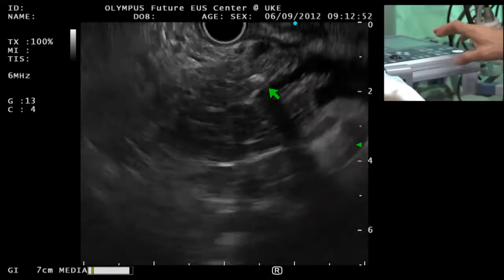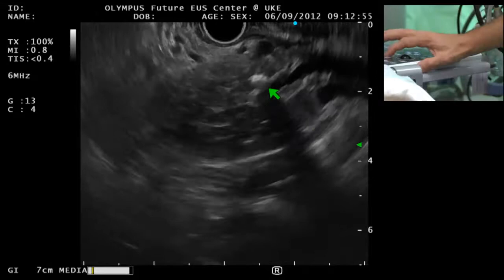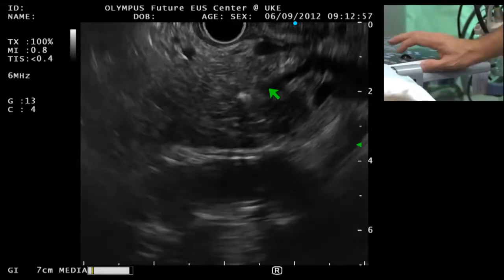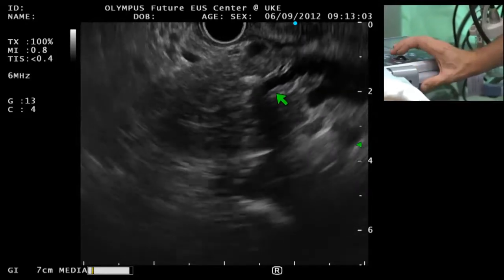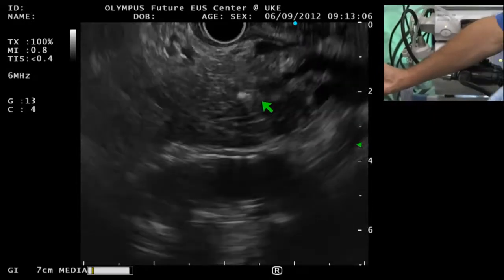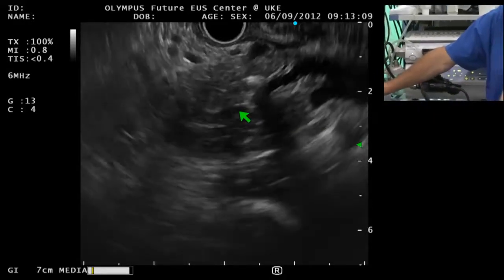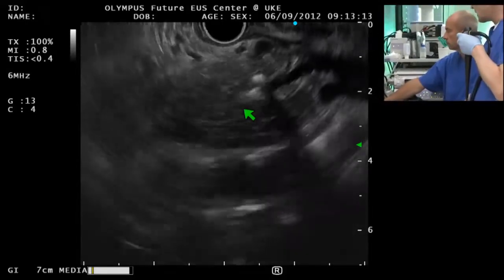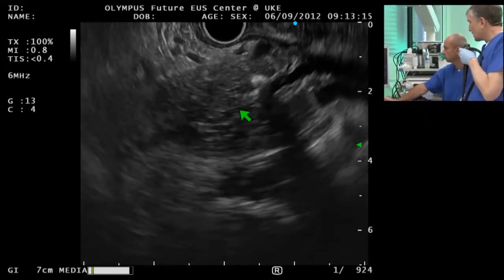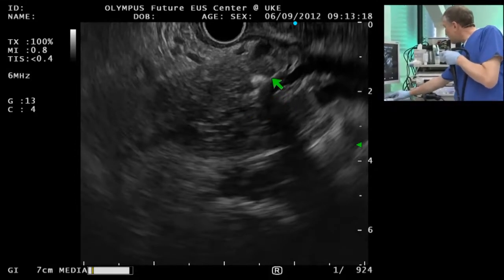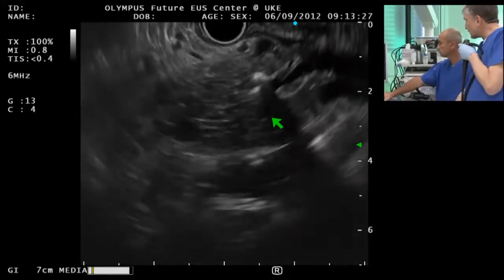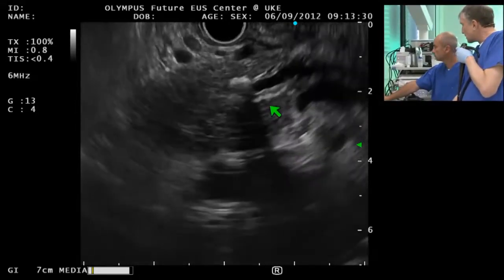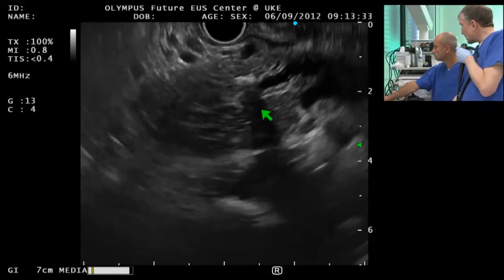Six millimeters. Because I was not really able on conventional EUS, on radial EUS, to see the transition. But I think here we see it very nicely. So here's the dilated duct, and here is the normal duct. And here's the transition. And there's at least — I'm not sure whether it's a classical intraductal stone or a calcification around the duct. It may be difficult to say, but I think it's a classic obstruction.